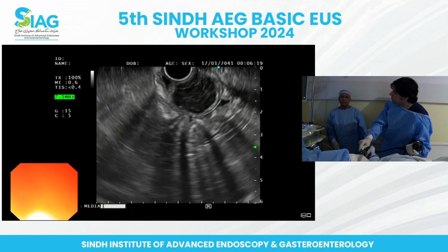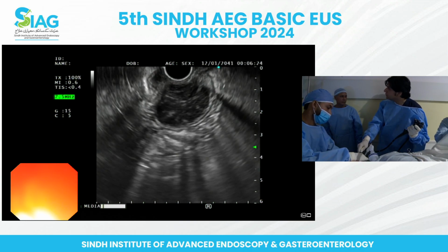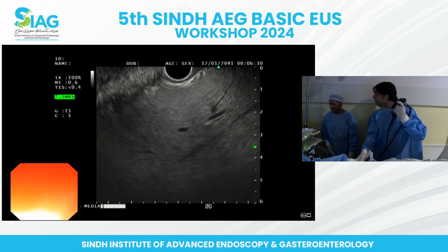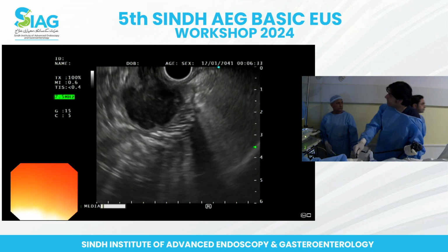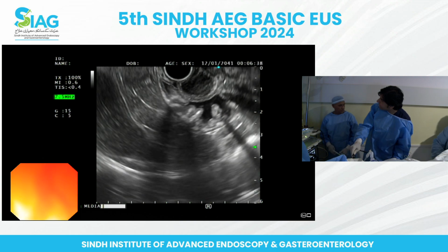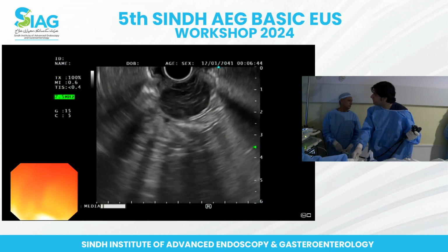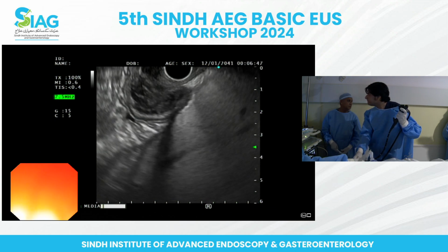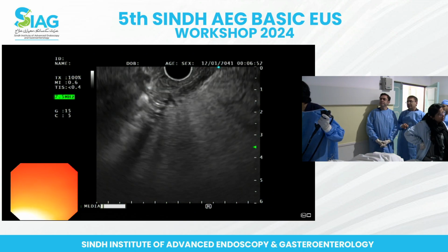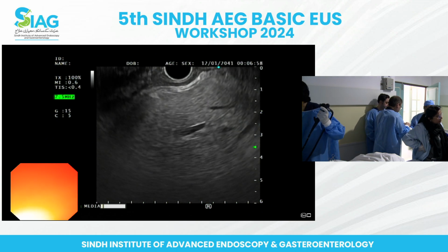So we'll just project the slides on the screen. We seem to have some cells. Go clockwise a tiny bit. Okay. Now go counterclockwise. It still could be just the layer, like could be a wall layer. Pull back a tiny bit. Understand. Yeah, तो वो भी हो सकता है. And go clockwise. Okay. Still वो जो fluid है ना हाँ. उसमें move हो गया. And go counter. But CT should pick it up, isn't it? MR, हाँ. हाँ. Keep going counter. Keep going counter. Other way. Other way.